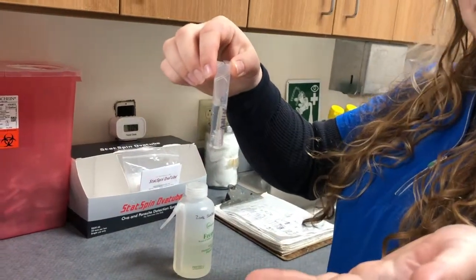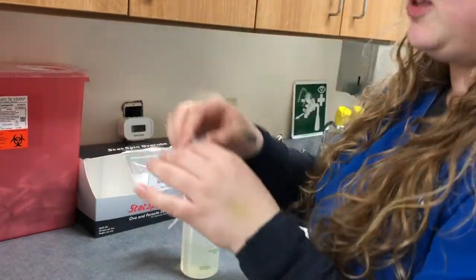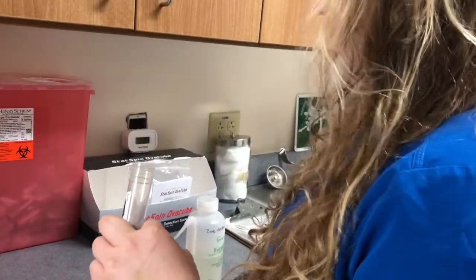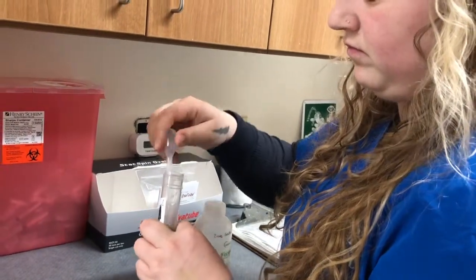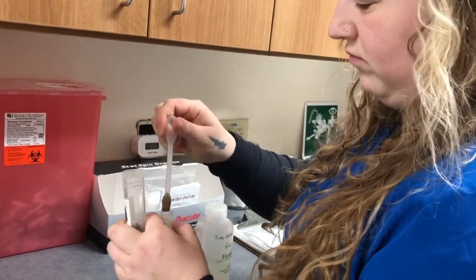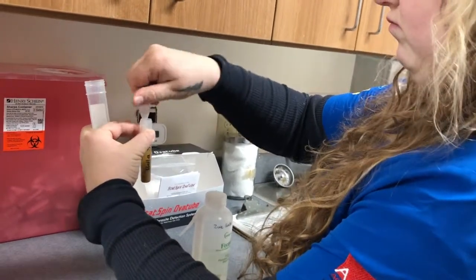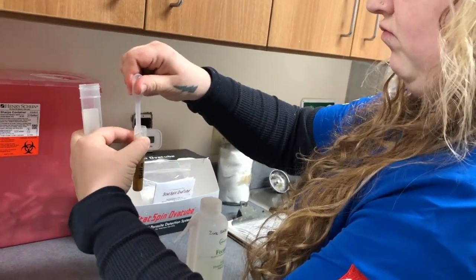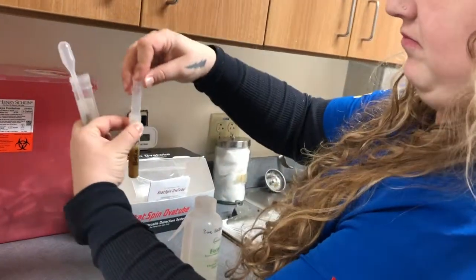What are you filling it with there? It's zinc sulfate — a solution that is more dense than the eggs we're looking for, so the eggs will float to the top, and that's how we find them. She's got a sample and she mixes it up thoroughly, because if those eggs are trapped inside organic material and fiber, we want them to be released, so we make it into a liquid sample so they're free to float to the top.